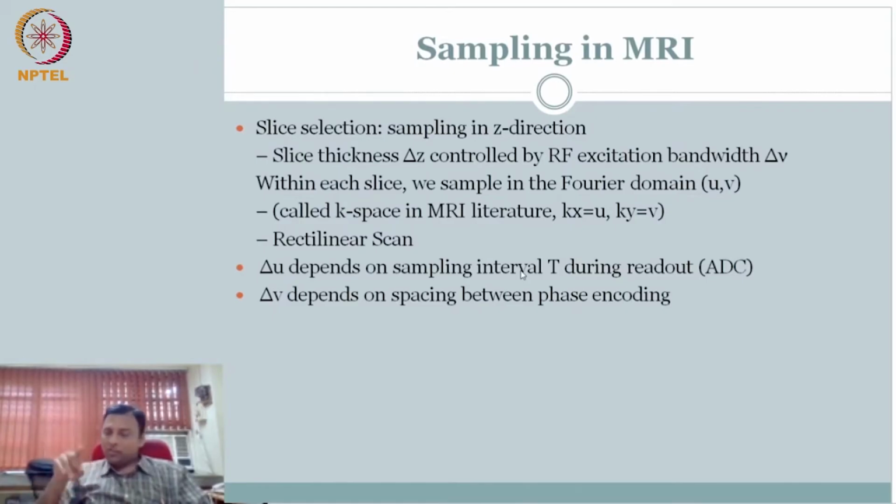So essentially you have sampled acquisition of your frequency domain. Delta V, in some sense you already saw, was the horizontal lines that we put, right? So there was a spacing. So that is actually discretized in some sense. U, we put an arrow mark as a line. So we always thought that it is continuous, but actually speaking, it's sampled data points that you have there. Delta V is more intuitive, okay? But we will have to relate these two.